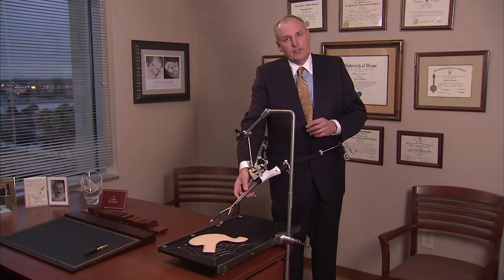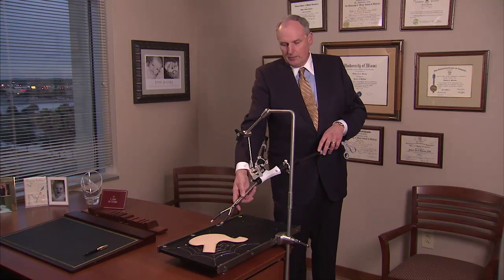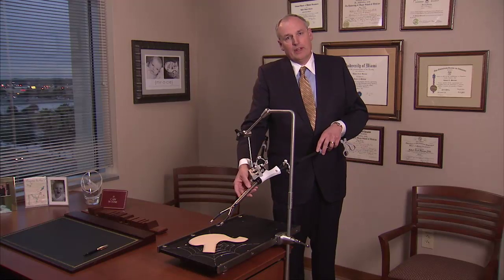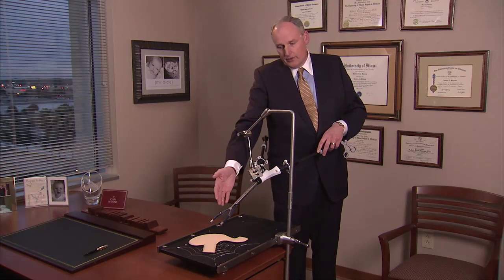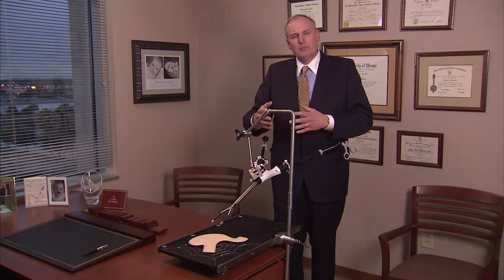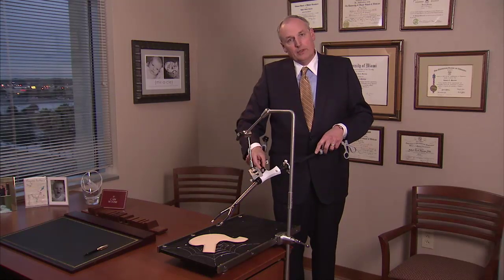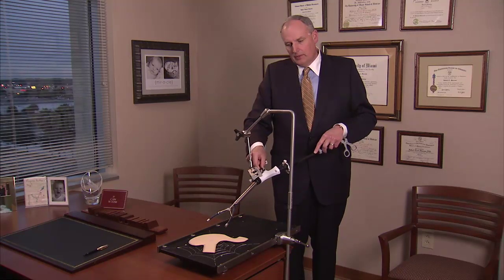Inserted through that small hole to the inside of your abdomen is this spider device. The portion I'm touching here is the portion that actually goes through that small hole. On the inside of your abdomen will be these arms that, like an umbrella as you open the arms, are able to be opened following insertion into the abdomen.